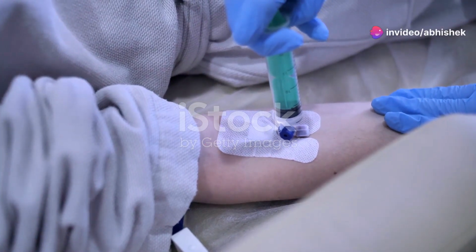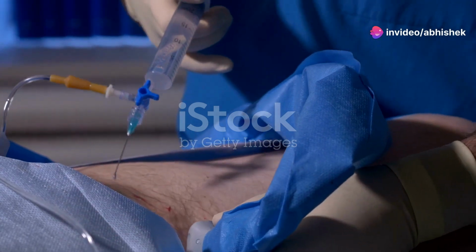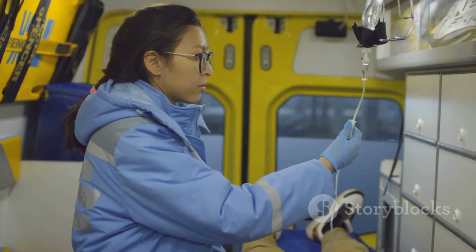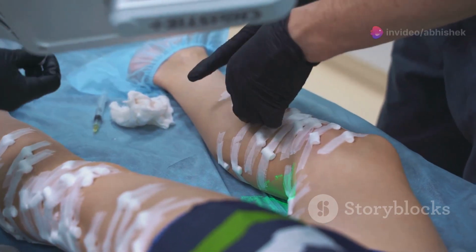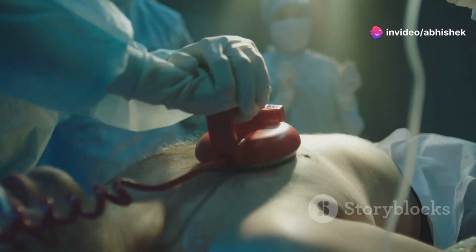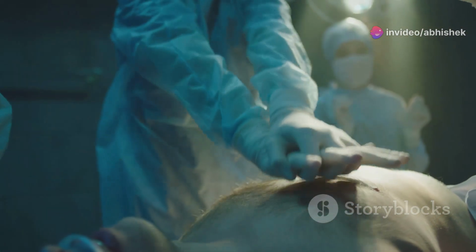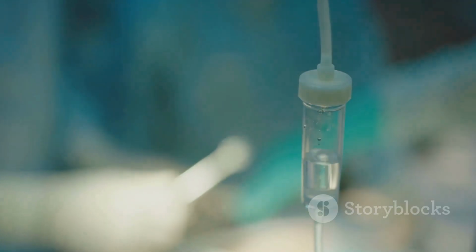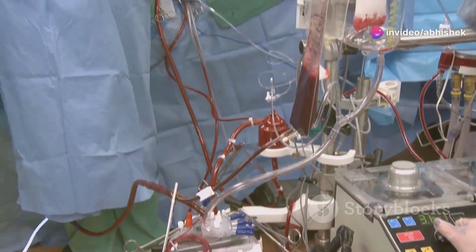IO injections deliver medication directly into the bone marrow. This provides rapid access to the circulatory system. It is used in emergencies when IV access is difficult or impossible. The most common site for IO injections is the proximal tibia, or shin bone. IO injections are used in critical situations such as cardiac arrest, to administer life-saving medications; severe dehydration, to rapidly replenish fluids and electrolytes; and shock, to improve blood circulation.